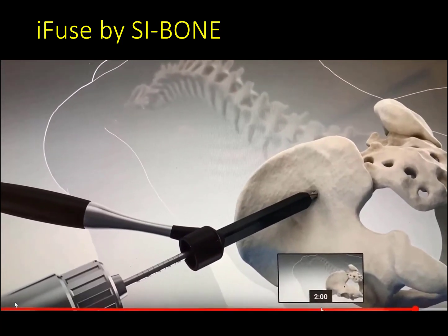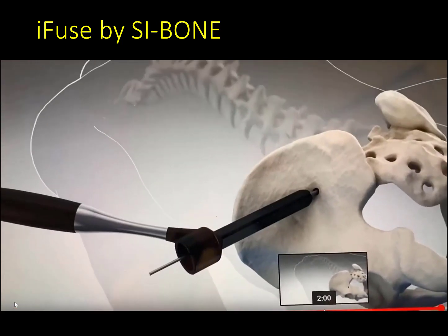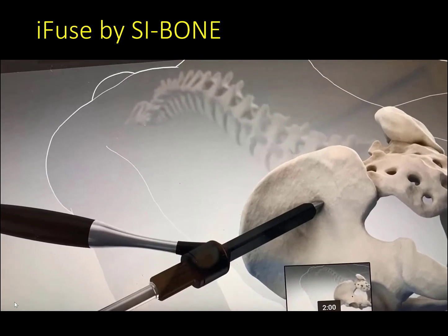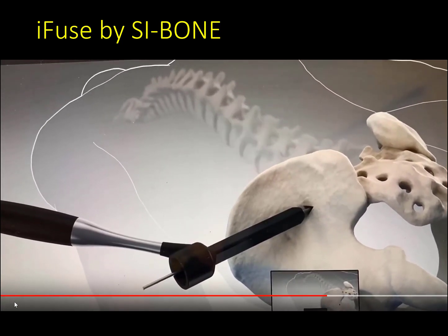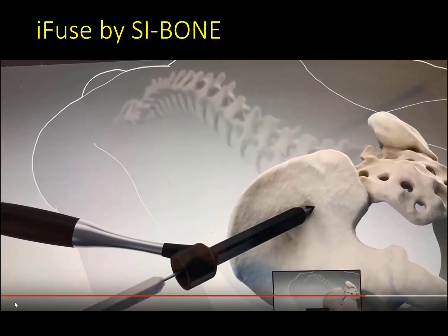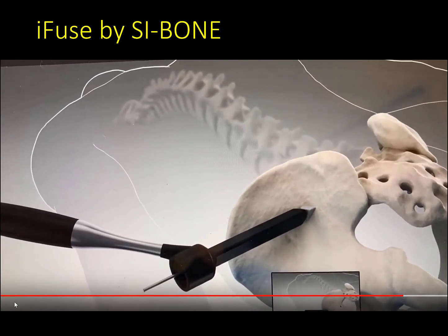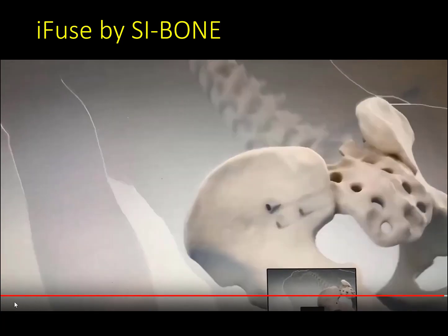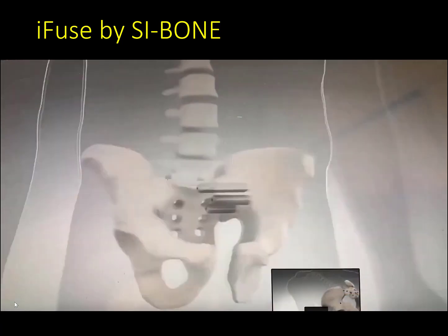You drill, tap, and then put the implant in, and the implant's triangular. The video just said immediate fixation. I cannot imagine that anybody who does any bony work in the pelvis thinks that there's immediate fixation with this. You're putting a metal dowel across the joint. If you think that really fixes it, that's fine, but it doesn't. They put 3. The third.